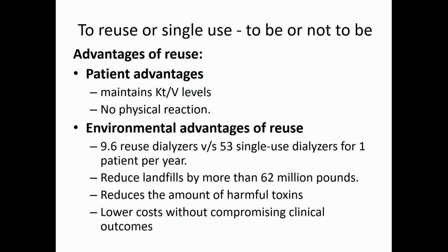For a reuse program, it is essential that the first time you use the dialyzer, the fiber bundle volume should be checked. You should not depend on the manufacturers. How many units actually do it? Before you start, if you have a reuse program, on the first use you must first check the fiber bundle volume, but it is easier to take the dialyzer and start using it.